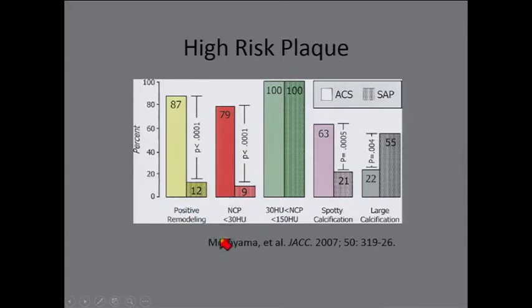Low density plaque, less than 30 Hounsfield units, was seen much more commonly in these patients. Interestingly, the intermediate plaque ranging between 30 and 150 Hounsfield units, which we often attribute to some type of fibrous, more stable material, was seen in both groups and in everyone.